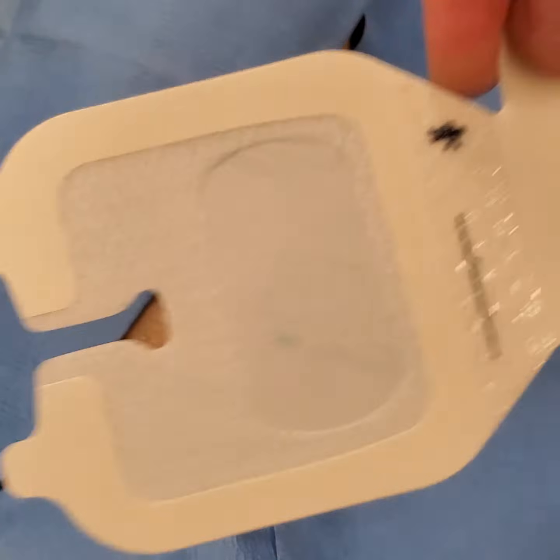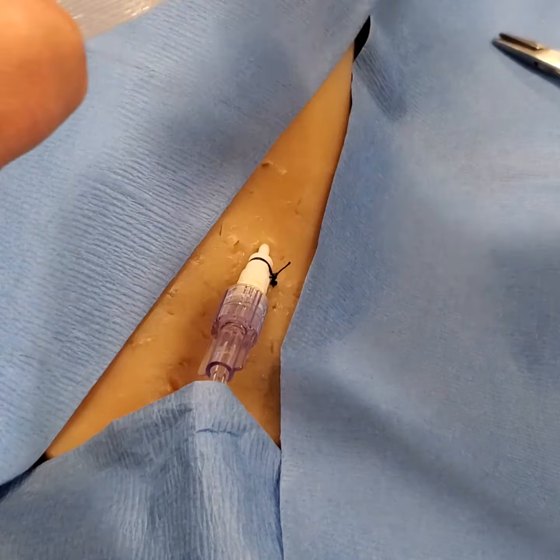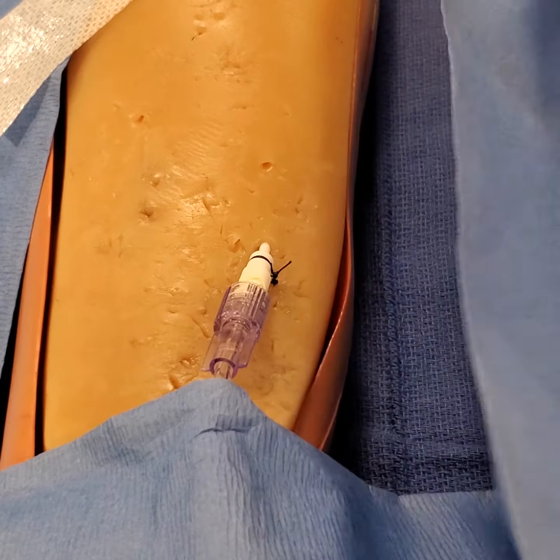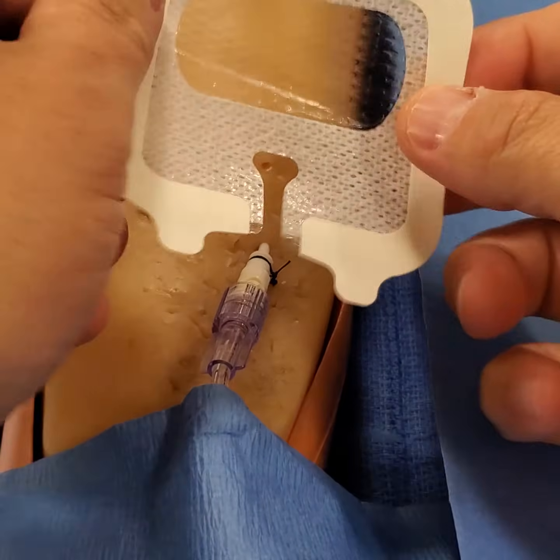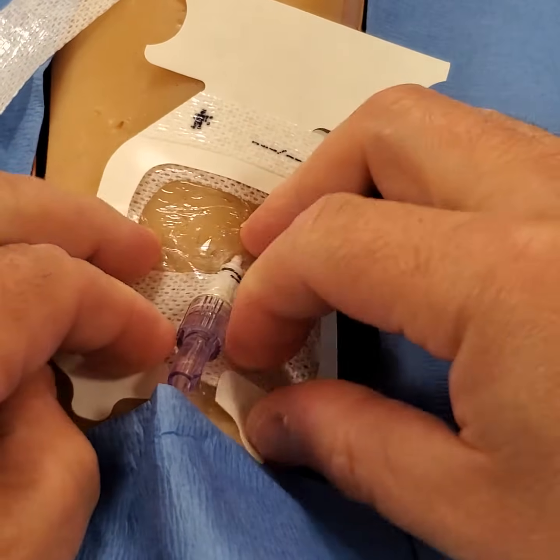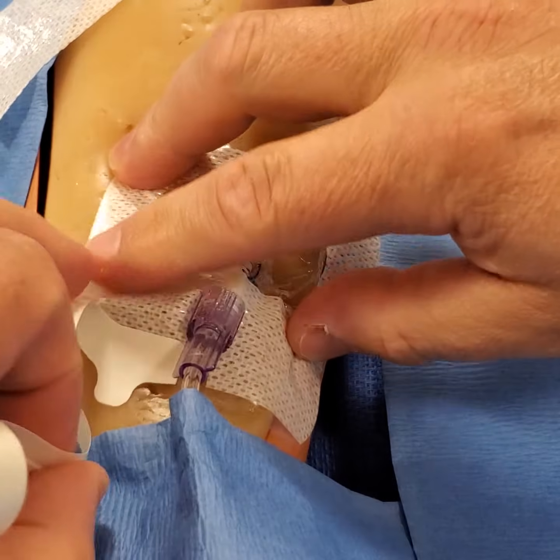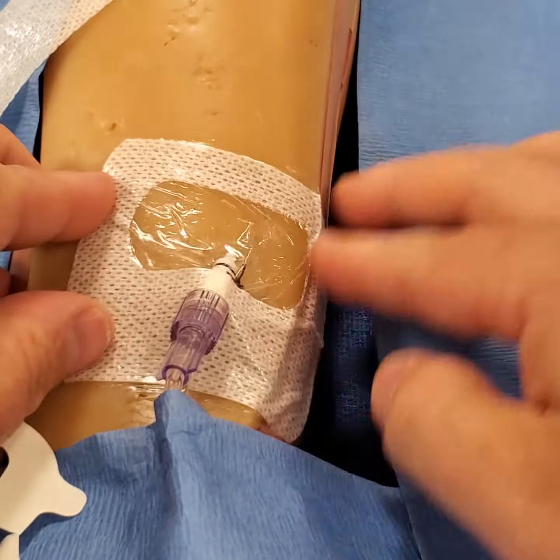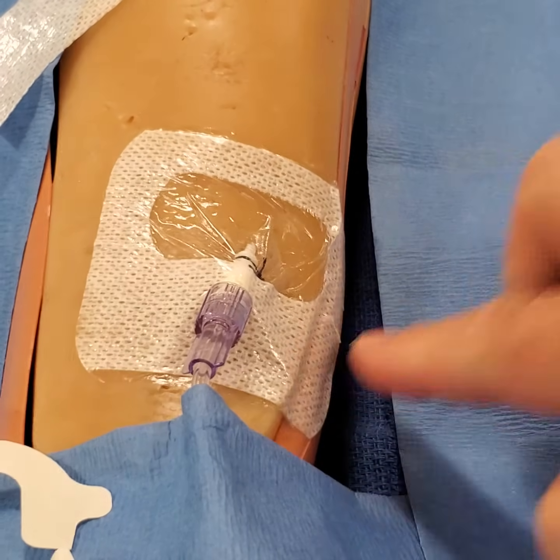You can then follow up with a Tegaderm IV Advanced. As it's sutured, you can remove your pre-placement anchor strip, give yourself some space, and then apply it pressing down on the skin and then removing the backing. Rub it on the skin to make it more translucent, which will help to secure it to the skin. Done.